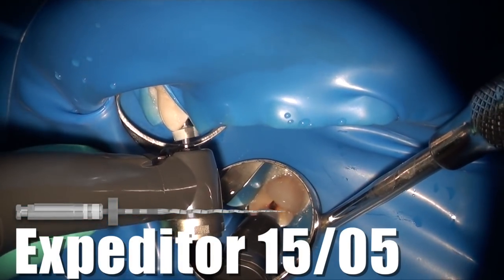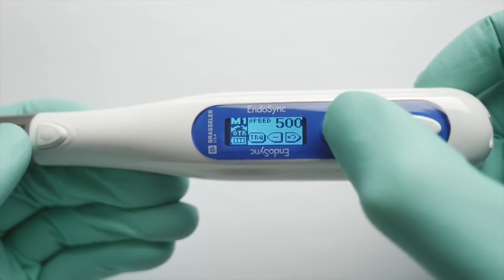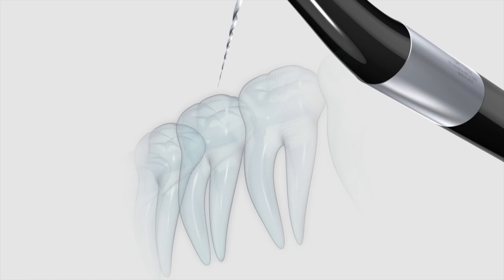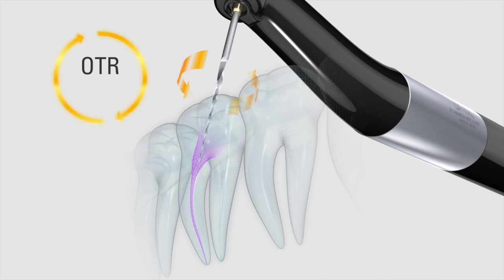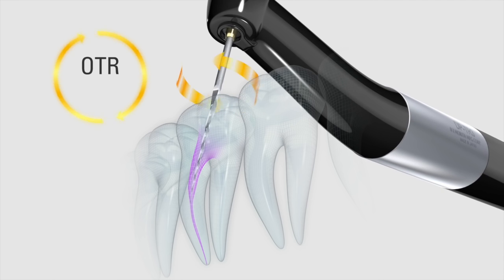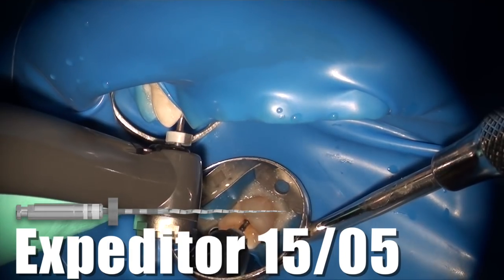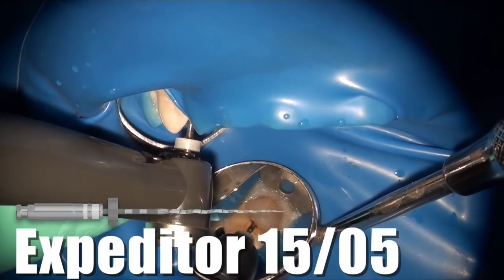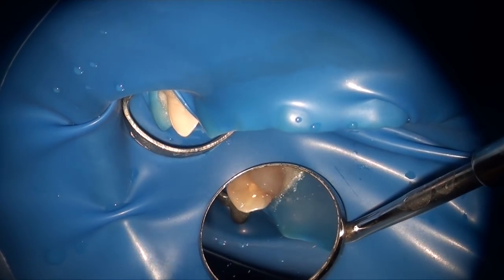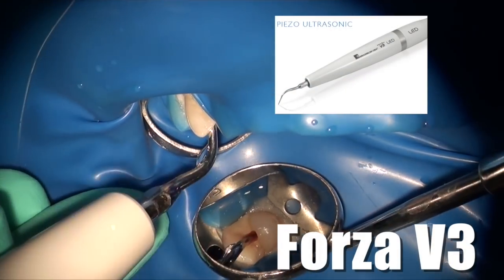I'm using the EndoSync and the EndoSync AI, and I'm using OTR motion. The OTR setting in this case has been set to 0.2, which is fairly low. OTR motion takes the file to a given torque setting, and if it reaches that, it goes 90 degrees counterclockwise before rotating forward again. I do three strokes with the expediter in the buccal and lingual canals each. Here there were just too many strokes — about five — you really should try to stick to three as a measure of safety.